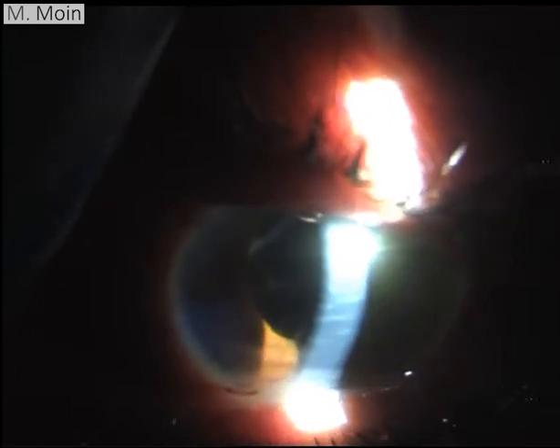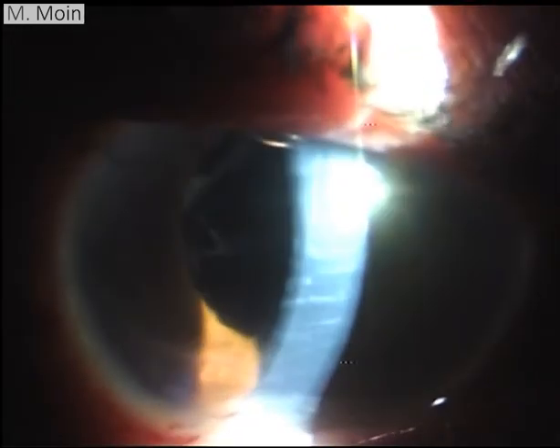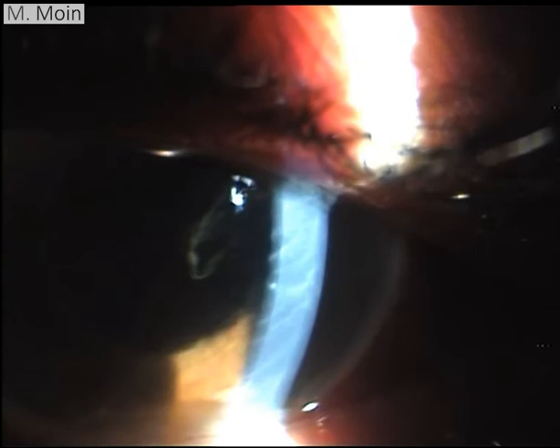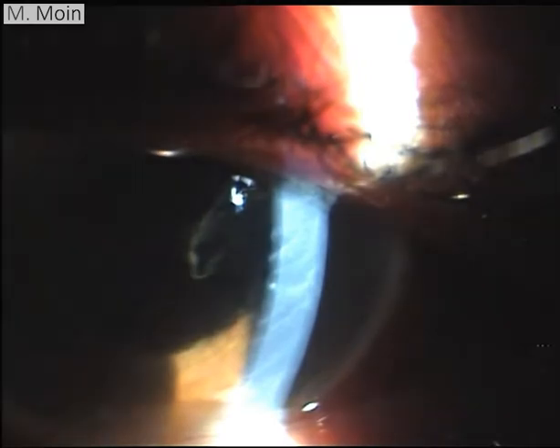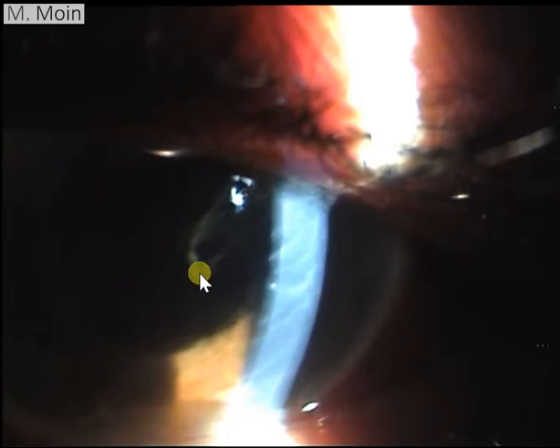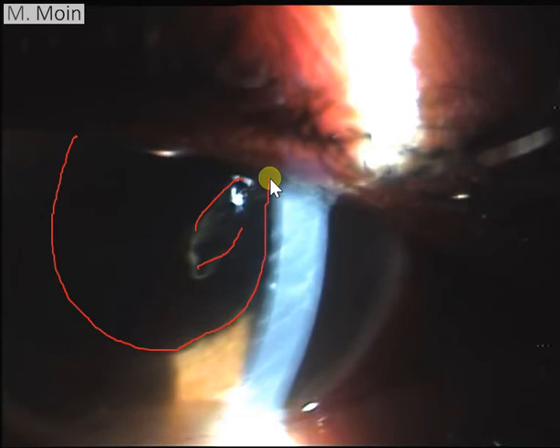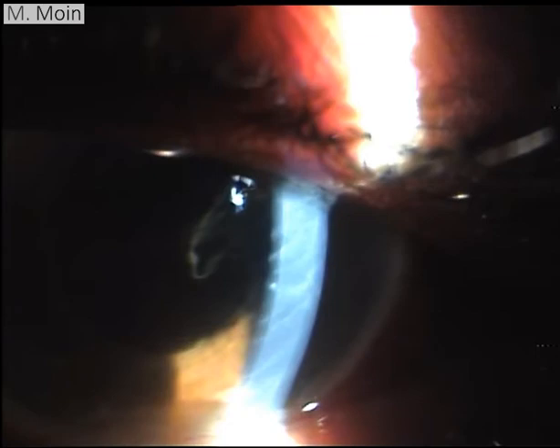Let's see. So this is the patient. Go on to higher magnification. Now you can see this horizontal striate keratopathy over here. And in the pupil, you can see there are some strands over here. This is the strand in the pupil. So the patient was actually aphakic. So the pupil is mid-dilated or probably less than mid-dilated, but the pupillary area is more of jet black in appearance in this area. So this is something which you have to see in these cases.